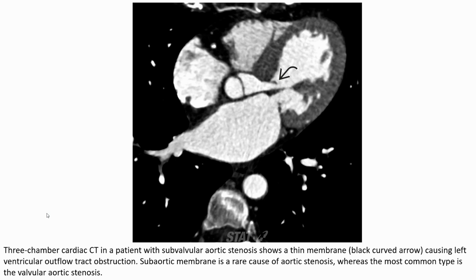Three-chamber cardiac CT shows sub-valvular aortic stenosis with a thin membrane causing left ventricular outflow tract obstruction. Subaortic membrane is a rare cause of aortic stenosis, whereas the most common type is valvular aortic stenosis.